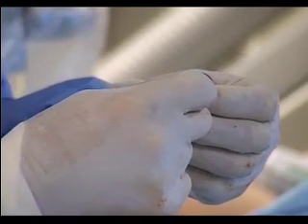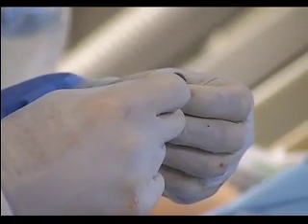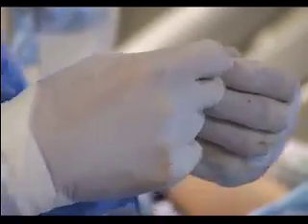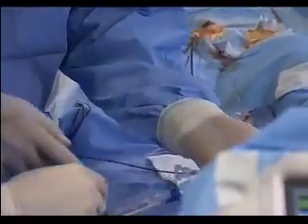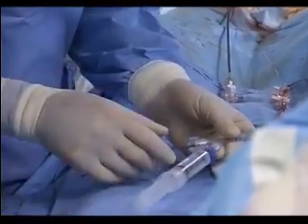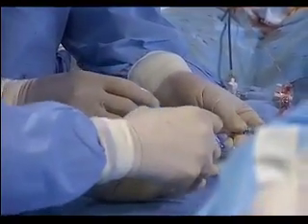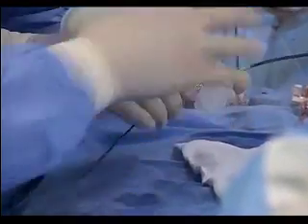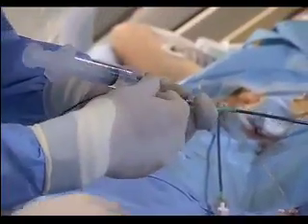Open that, Muhammad. Open it. And pull the cable tight. Good. We all know the mechanism of this device, and now what we're going to do is do it under the water seal. And basically, flush to the end. Okay, good. Like this.